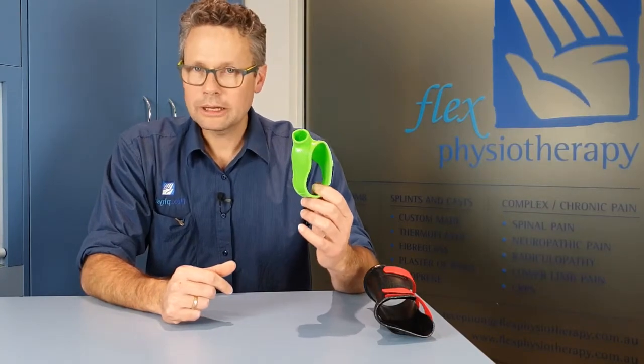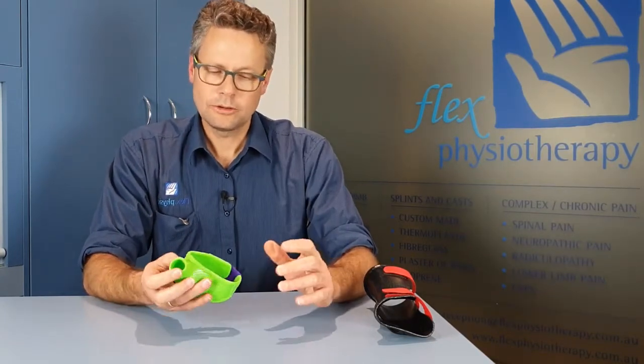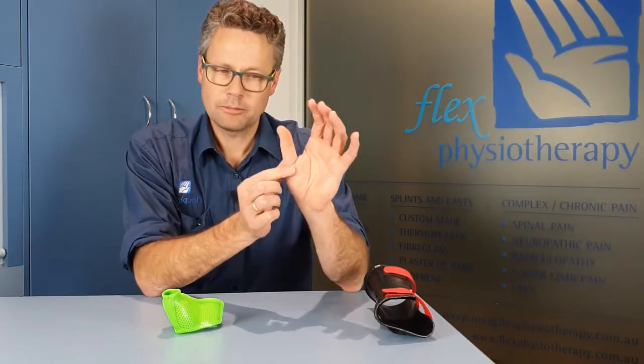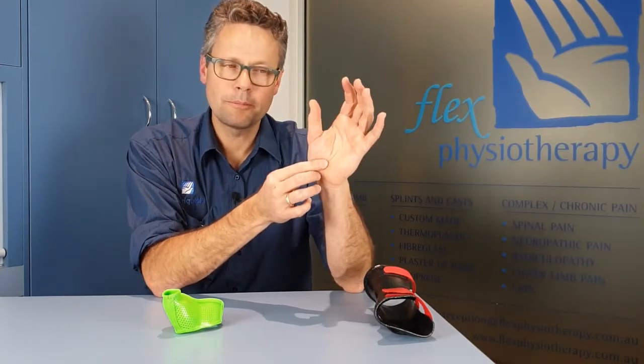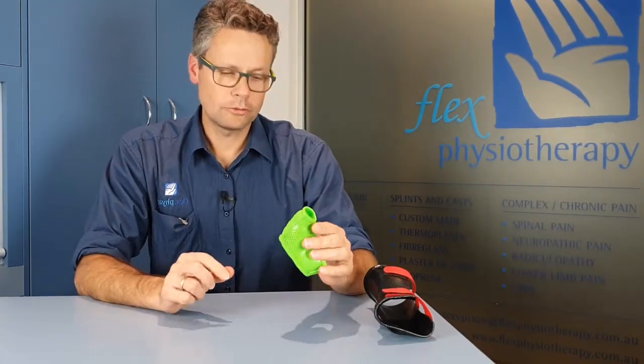This is a very commonly used splint. We use it for all sorts of thumb injuries — it might be ligament injuries in this joint here, some simple fractures of the thumb, arthritis, or pain problems at the base of the thumb. A very useful splint indeed.